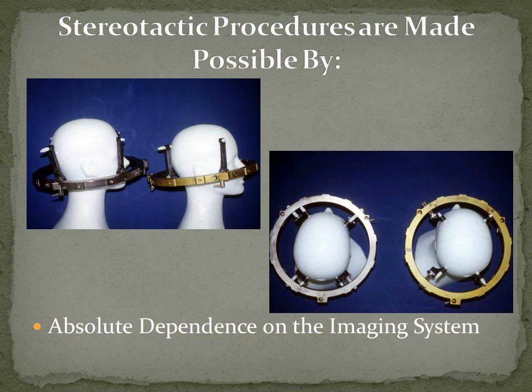While you'd like to get it nice and symmetric, and you'd like to get the ring slanted along the AC/PC line, there are situations where that's not going to be possible. Patients have bone flaps. Patients have sloping foreheads.